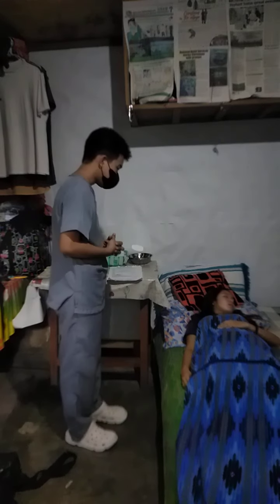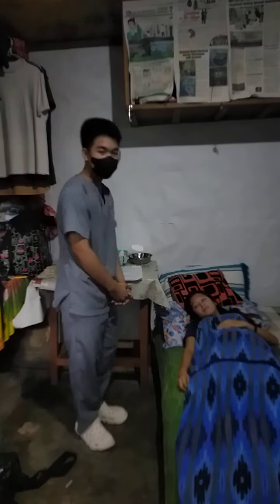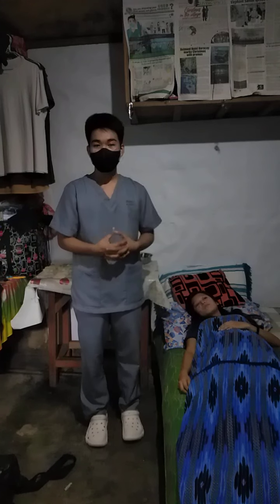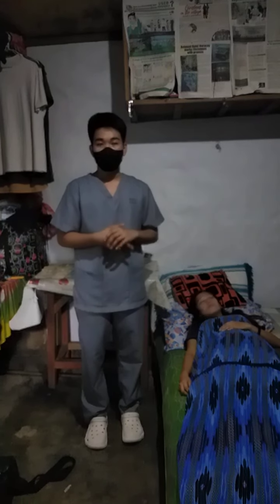So, good afternoon, ma'am. I am Surab Buisan. May I know your name po? Arian Merin. Miss Arian Merin. Thank you po. Explain the procedure to the patient and explain why the tube is needed. Discuss the associated discomforts that may be experienced and possible interventions that may allay this discomfort. Answer any questions as needed.